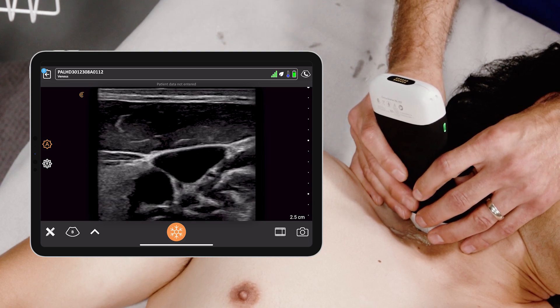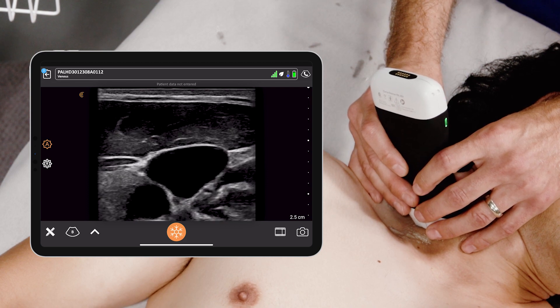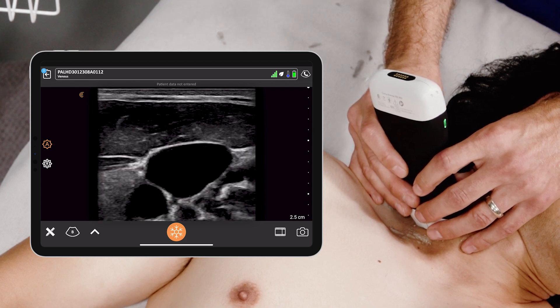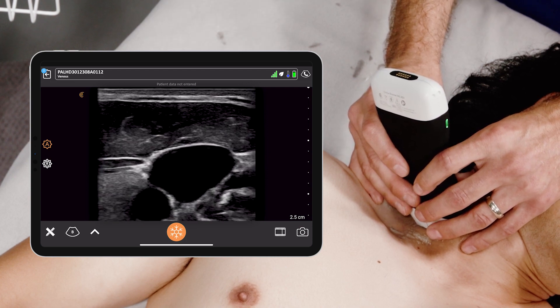When I compress down, you see that the internal jugular vein compresses as well, and that proves it's a vein. What you want to stay away from or also identify is the carotid artery.